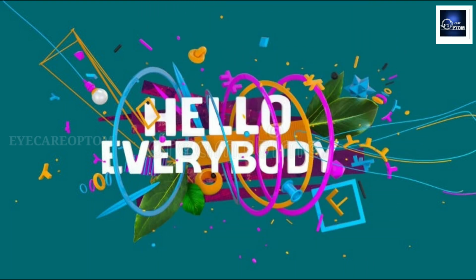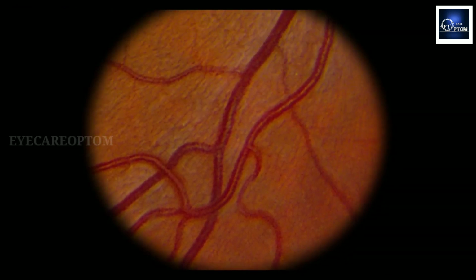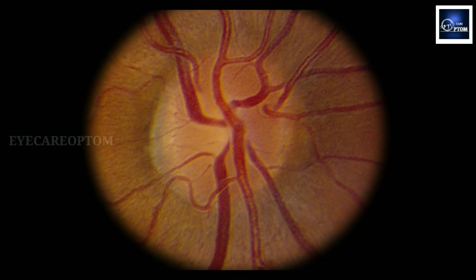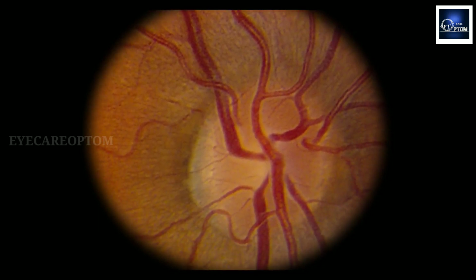Today I'm going to discuss how to perform direct ophthalmoscopy. The direct ophthalmoscope is used for examining the posterior part of our eye, parts like the macula, optic disc and cup, and posterior retina. Sometimes it can also be used in media opacities. The main important thing about the direct ophthalmoscope is that we can use it in undilated pupils also.